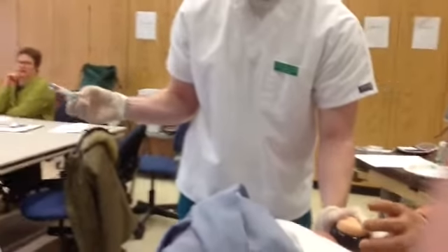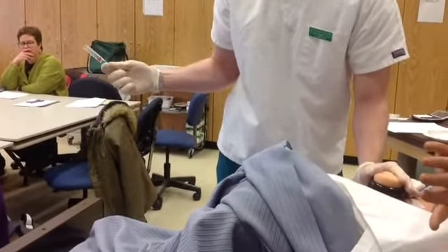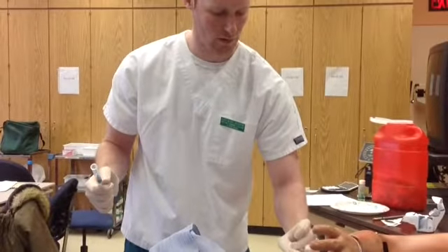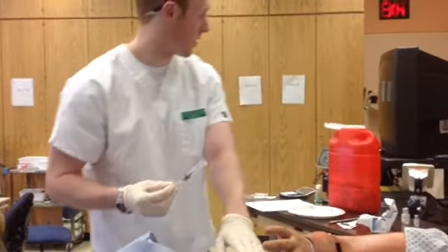Take out the needle. Put the safety on. Then apply the gauze. And I'm going to apply pressure.